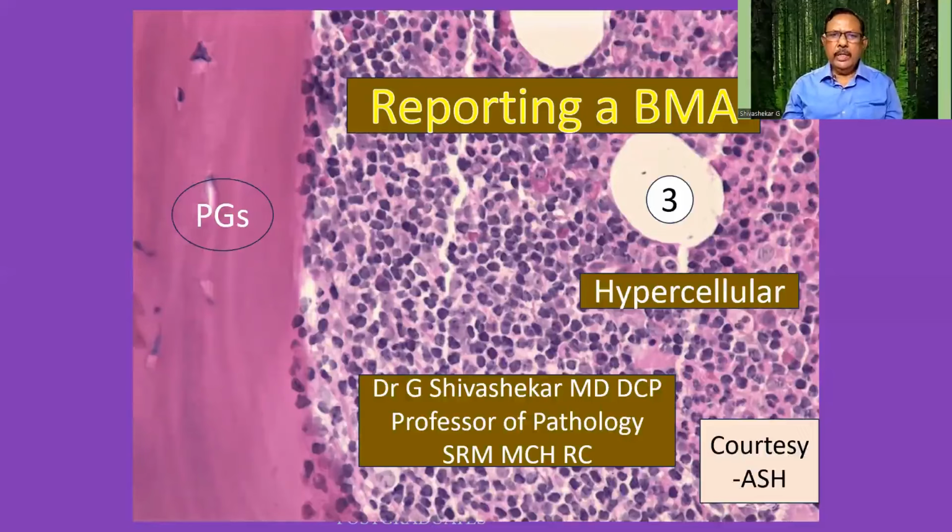We shall go to our third class on bone marrow aspiration. And the theme is hypercellularity. In the background, I am finding the bone marrow flooded with cells, thanks to the American Society of Hematology for this wonderful, knowledgeable picture.